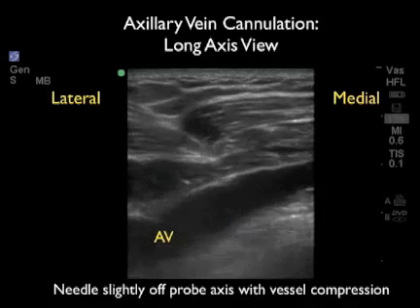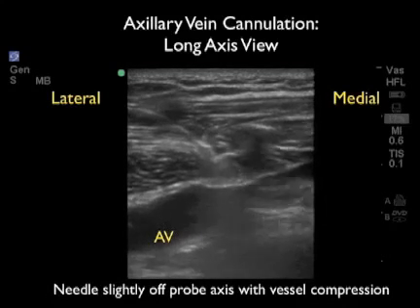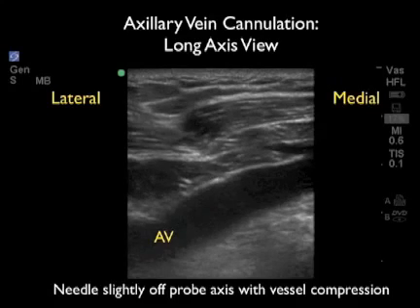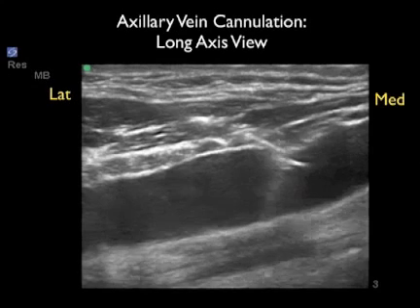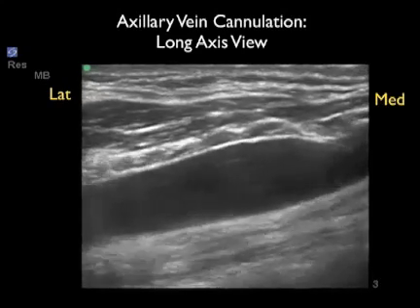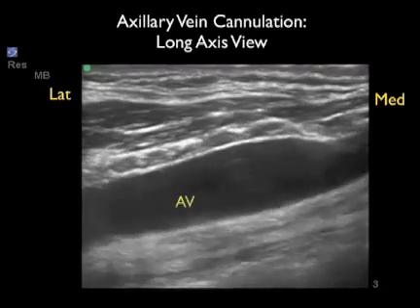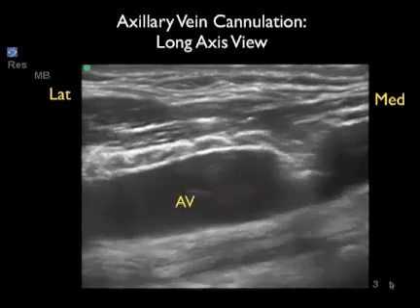And this is one pitfall from using the long axis approach, that you must be completely in plane with the needle throughout its entire path down to the vessel. Here's another clip in the long axis orientation showing a successful cannulation of an axillary vein. We can see here the needle pushing down on that anterior wall and then entering into the vessel lumen.